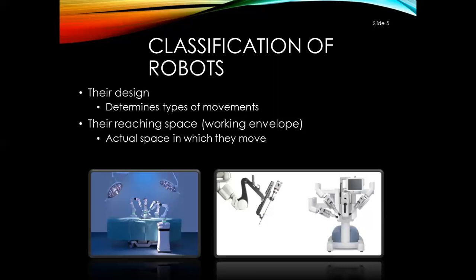One thing you need to understand is what we call telesurgery, okay? Telesurgery is where instruments are inserted manually or with electric assistance, but are controlled through a remote, non-sterile console near the sterile field. So with Da Vinci, and we'll talk about the console in a minute, the console is one part of the room, and then the cart is somewhere else with the arms on it. So that's considered telesurgery. Also, telesurgery can be if it's by phone or by video, okay? where it can be worked through from another location to that particular hospital.